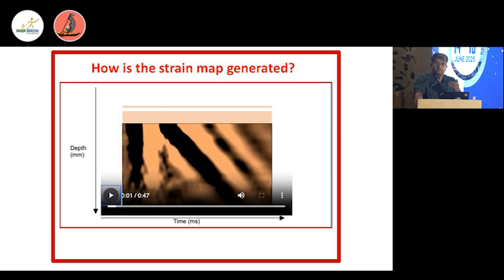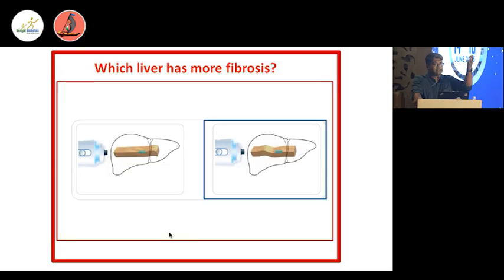Right? And what does the velocity of a wave depend on? It depends on the density of the medium. As you all will recall, we can hear the sound of the train engines from the rail station in the morning. And we can hear them better in the winter. Why is that? Because in winter the air is colder, the air is denser, there is more fog, and the sound carries better from a longer distance. So the velocity of sound, the carrying capacity of the wave, is more if the medium is dense. So this is the exact principle of FibroScan.